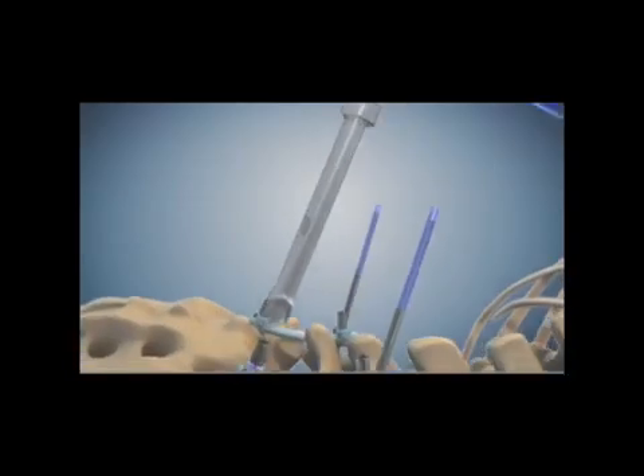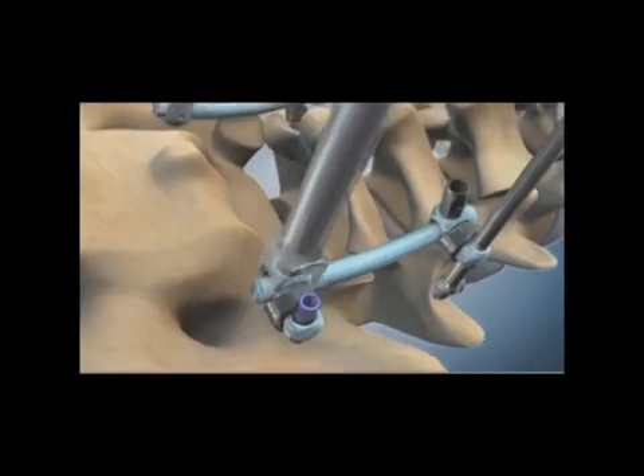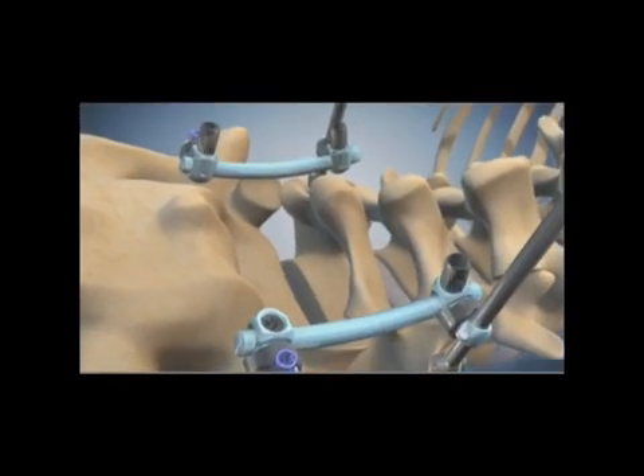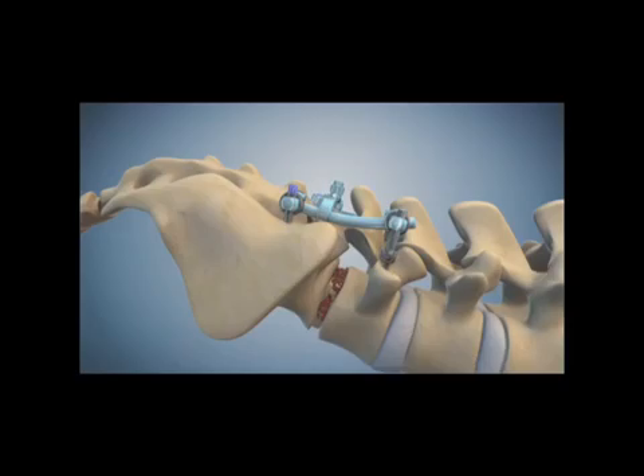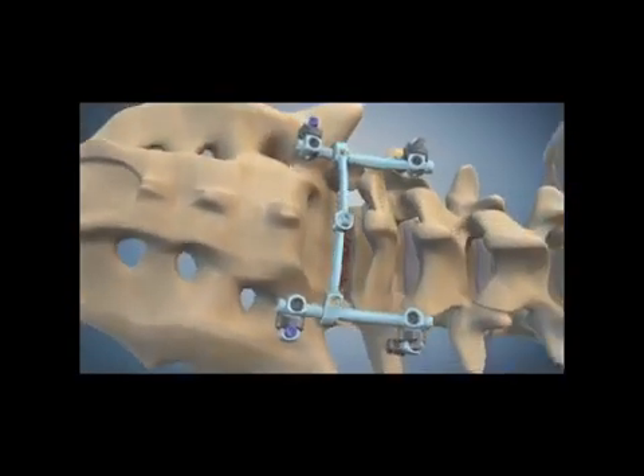The pop-off tops of the set screws can then be removed, securing the rod on the screws very tightly. The excess length of the reduction posts are then removed. A cross-link can be used if needed, and bone graft is applied. That's how you correct spondylolisthesis using 3DX.